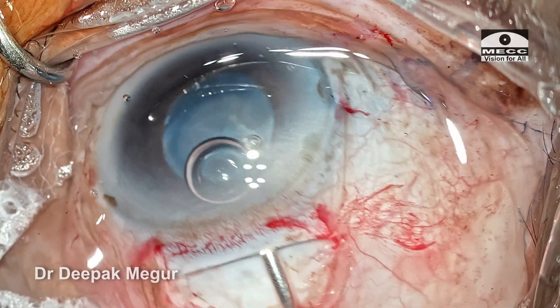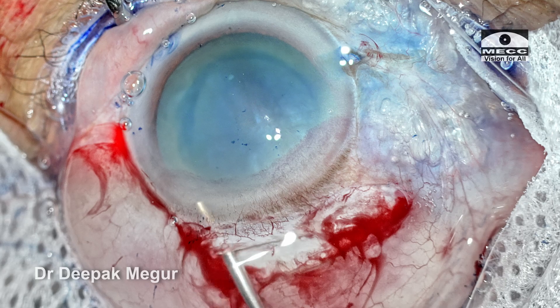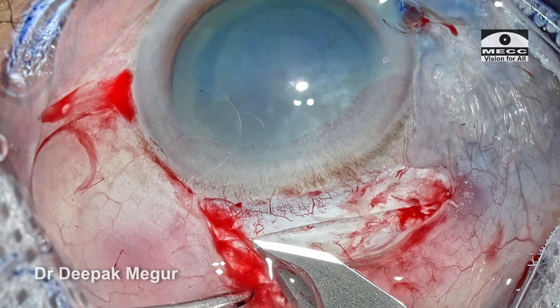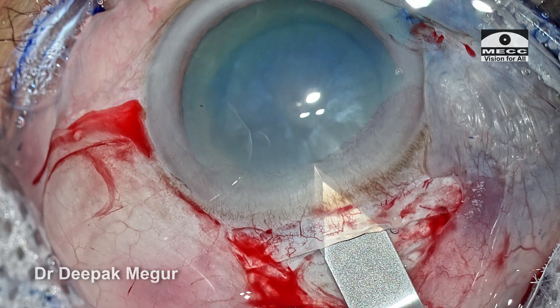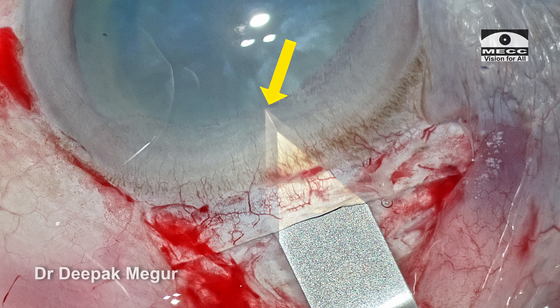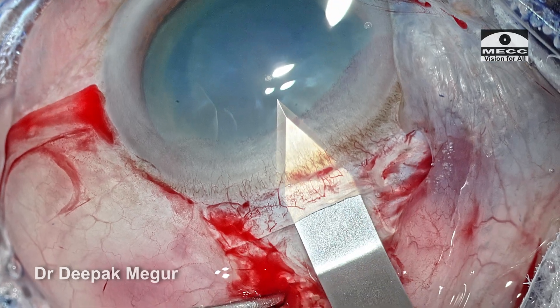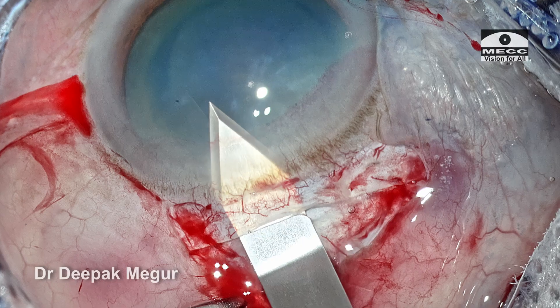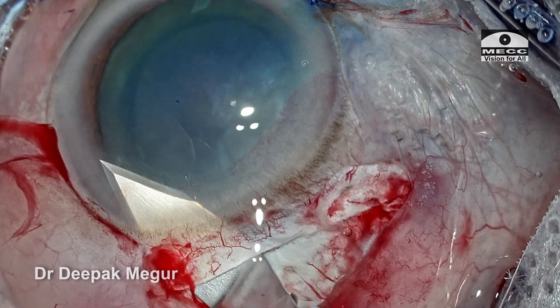Once we have created the sclerocorneal tunnel, it is time to enter the anterior chamber and create the internal entry. Viscoelastic in the tunnel delineates the boundary of the internal lip. A bevel-up sharp keratome measuring 2.5 mm is slid into the tunnel until it reaches the end point of the internal lip. As we touch the internal lip, a small dimple appears — this is the point at which we need to enter. The blade perforates the inner wall of the corneal tunnel and enters full thickness into the anterior chamber. The internal lip is then extended laterally on either side until it spans the entire width of the corneal tunnel created initially.